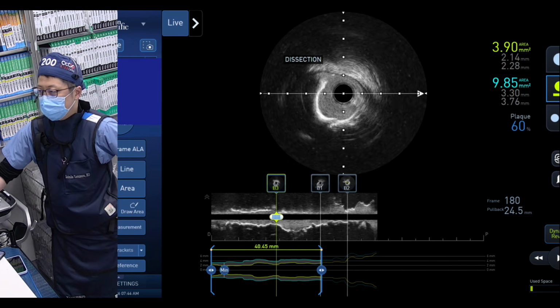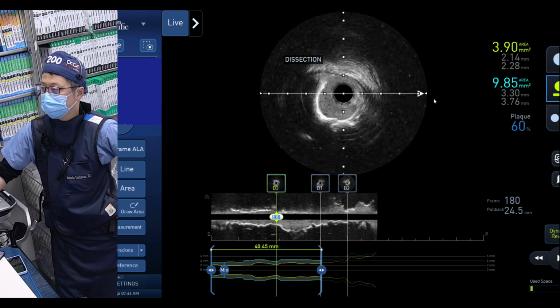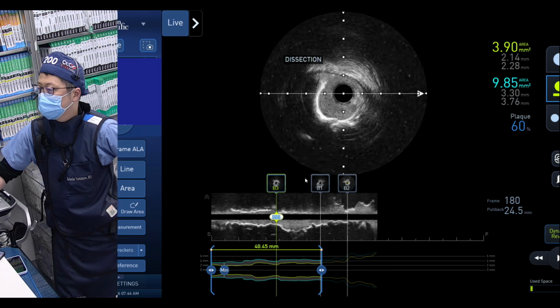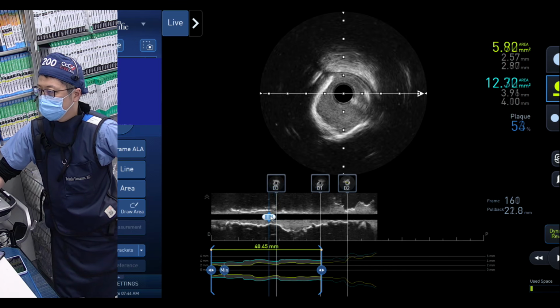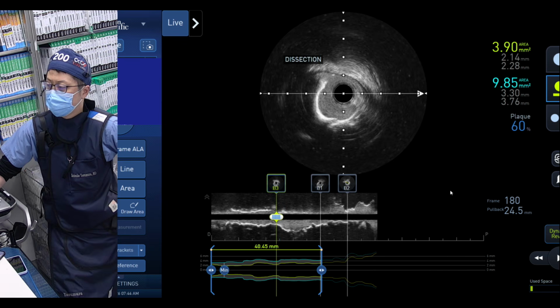Maybe a small fracture. Yeah, plus fracture, based on the edge of the IVUS, plus calcium, minus. But see, where the calcium is meeting the fibrous tissue, that is that deep medial cut, and that's what we have to be careful about. Keep it there. It could be deep and can cause what we call a contained perforation, which we have seen in many cases. You see that there?